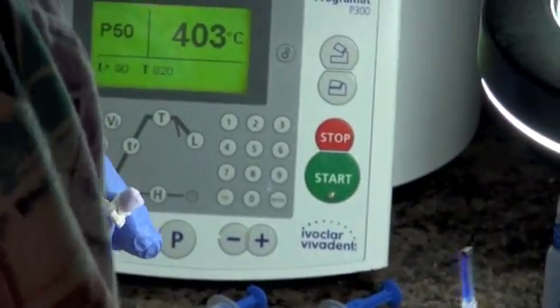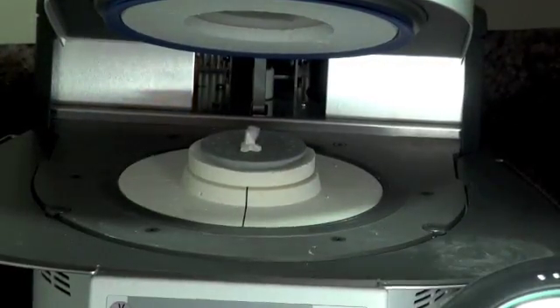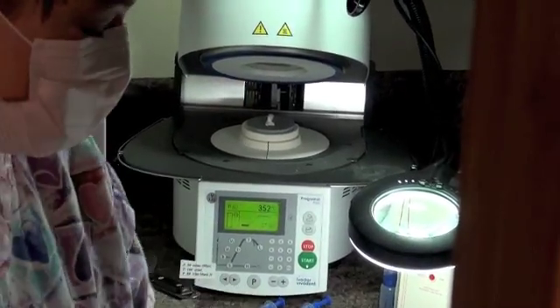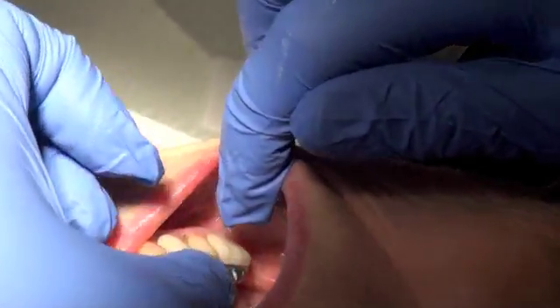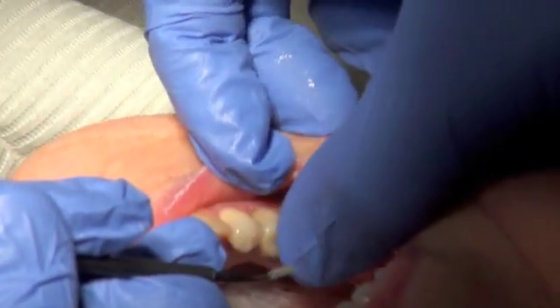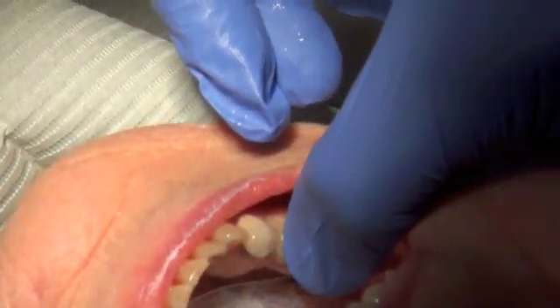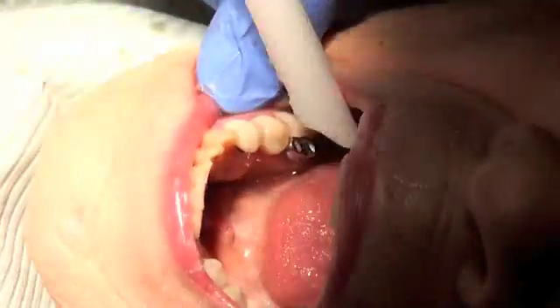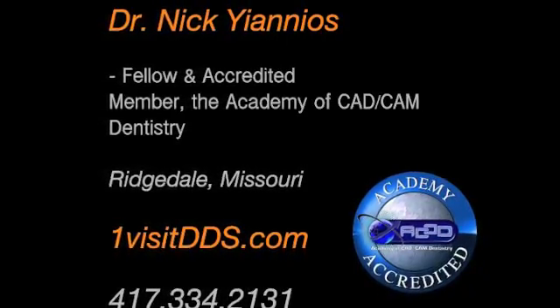The crown was then customized to match the patient's natural teeth using stains and glazes. Akin to glazing pottery, the crown was placed under heat and vacuum to permanently integrate these colors, greatly strengthening the porcelain and forcing a phase change whereby the blue porcelain becomes tooth colored. Thirty minutes later, the tooth is now tooth colored and ready to bond in the mouth. Notice the isolation mechanism again, which helps ensure an excellent bond between the porcelain crown and the remaining natural tooth structure. Isolation protocols are paramount to ensure successful CAD-CAM outcomes — finished permanent crown the same day with a better seal, absolutely no metals, and a perfect bite. Time elapsed: under two minutes.